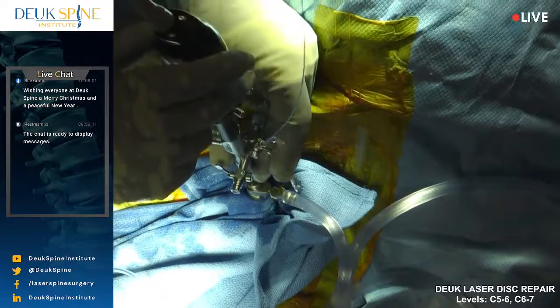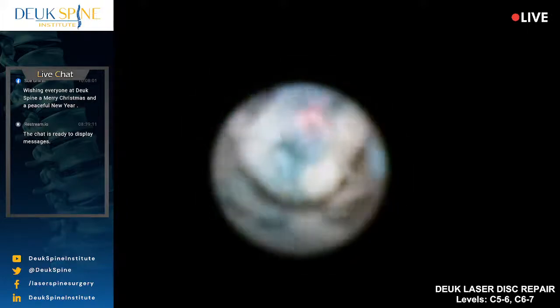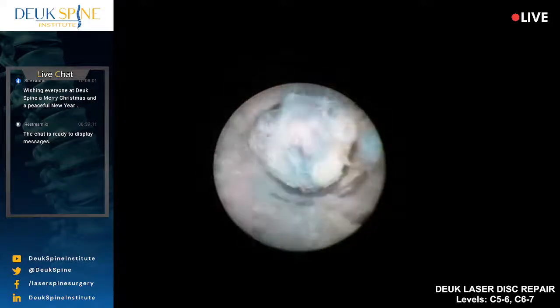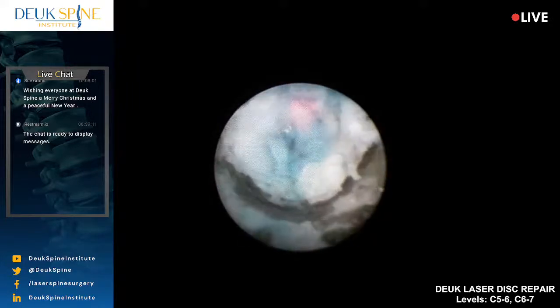All right, so we're going down the tube. At the back here, we have the tear in the back of the disc with the herniation. So I need to focus the camera so we can all see a little bit better. Give me a moment. There's the focus. Beautiful. Now, because we live stream, we're able to take questions during the surgery. So if you have a question, type it up and I'll answer it for you.